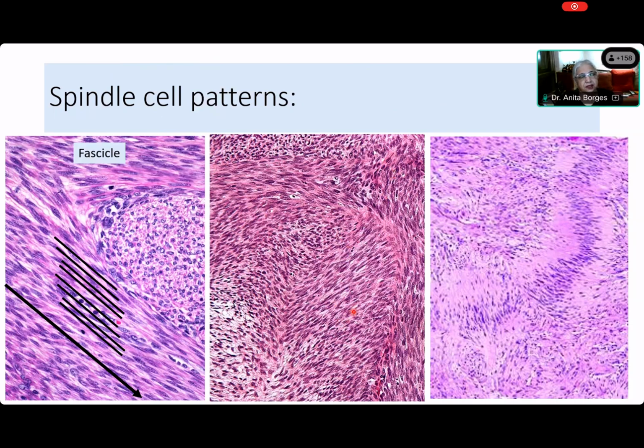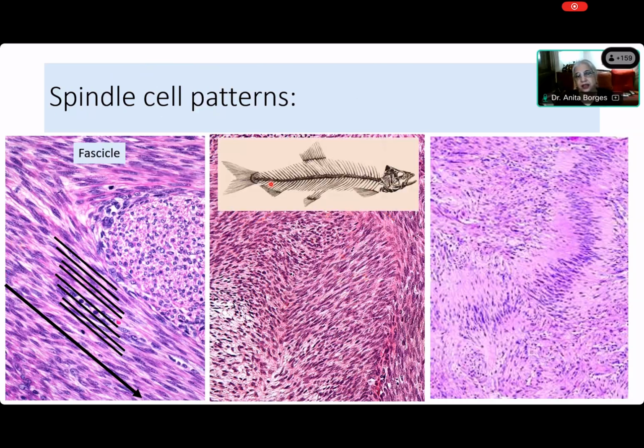Use the thickest, any color that you want, but use the thickest, the little dots at the bottom. Press on the thickest dot, and show me where you can see the herringbone. You're right, it is herringbone. Oh, it's going. That is not a herringbone. No, here, that's not the herringbone. So let us see where the herringbone is. Okay, here. The herringbone is here. You see it. That is the herringbone.